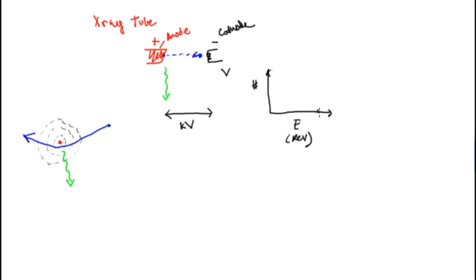And so the potential is going to be the largest possible energy X-ray that comes out. You can't have any X-rays above this value of keV. Let's say it's 120 keV. You can't have any above that because there's nothing with energy above that. As you go to lower energies, you get more photons out, though, and it kind of looks like this. This is a typical Bremsstrahlung spectrum coming out of a tube. So more photons at lower energies.